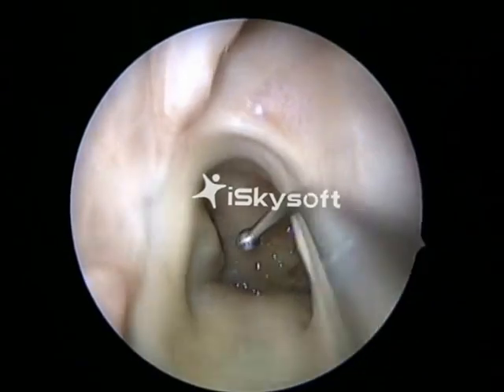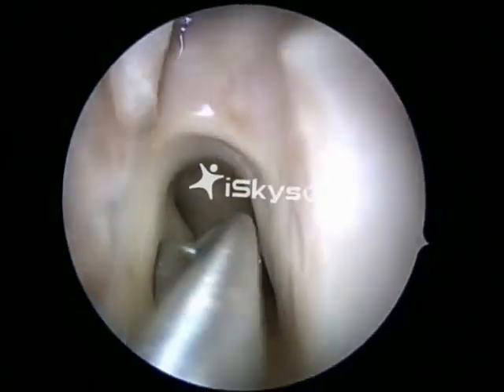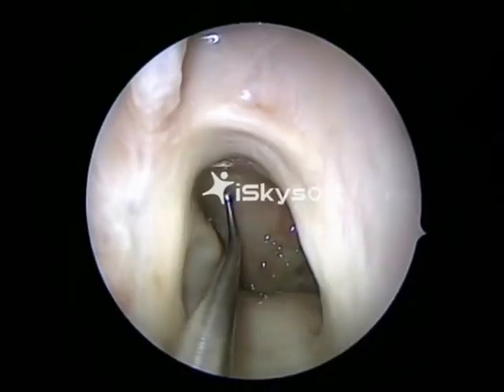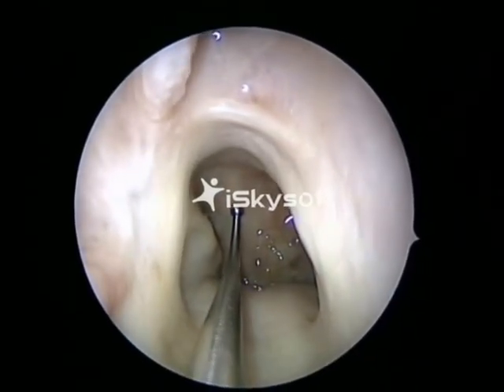Now we will see the landmarks in the nasopharynx. That's the eustachian tube orifice. That's the fossa of Rosenmuller and the region of the adenoids.